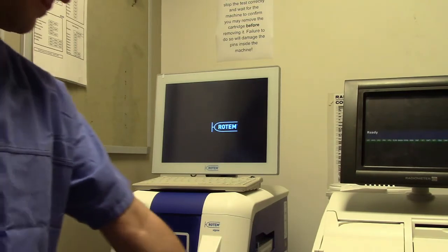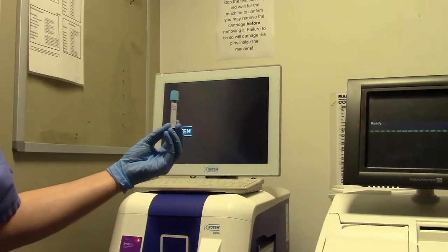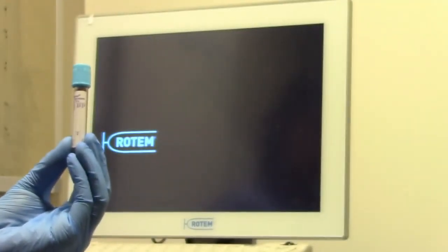You will need to have 2 mLs of blood in a small blue top vacutainer and have the patient barcode ID attached to the tube, or write down the patient details on the tube.